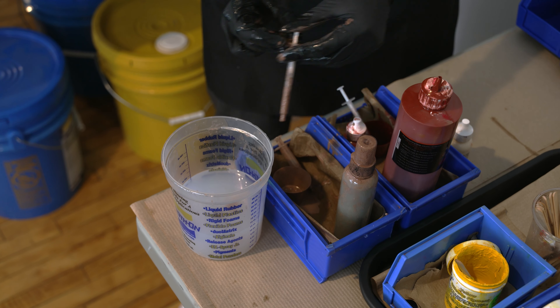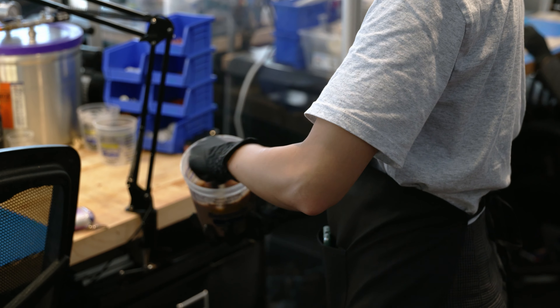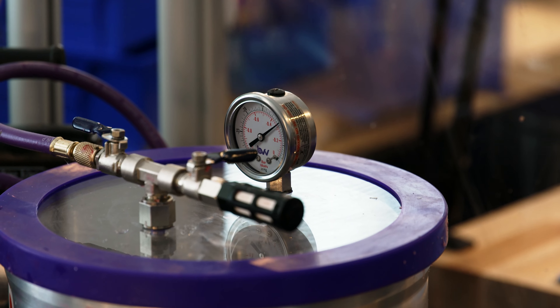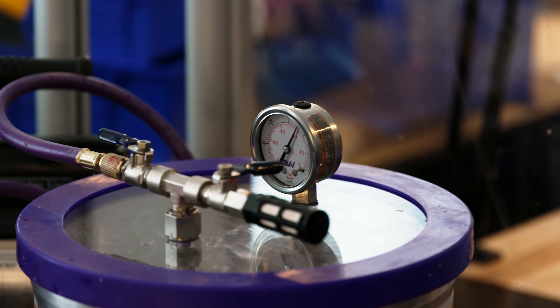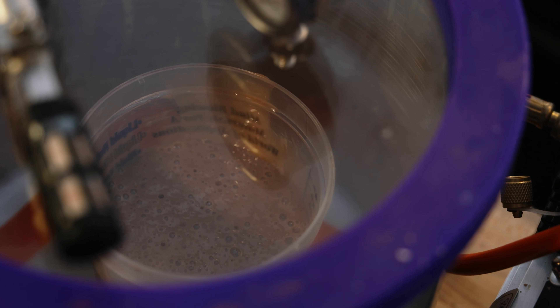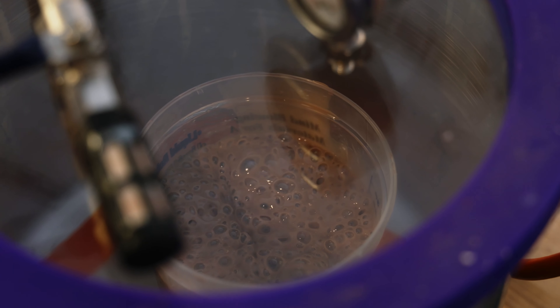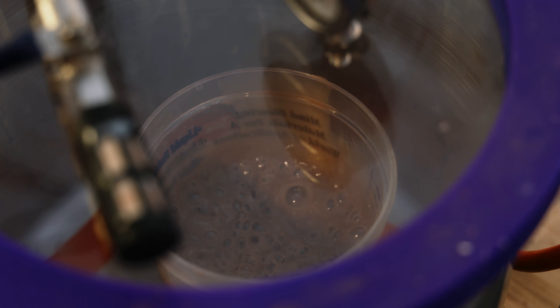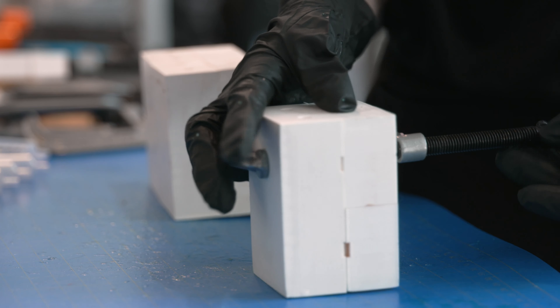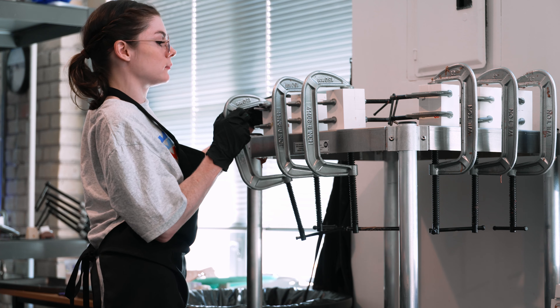Injection molding is used to make the muscles and skin components of our simulators using silicone, due to its soft nature similar to human tissue. Injection molding is a process used to produce parts by injecting material into a mold cavity, which is cured and hardened to the shape of the cavity.